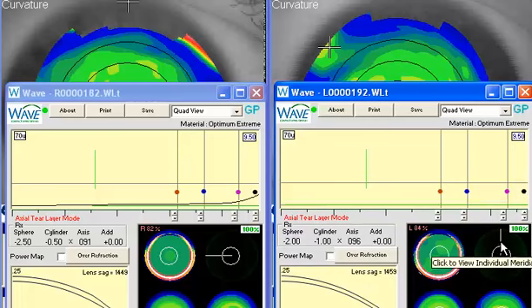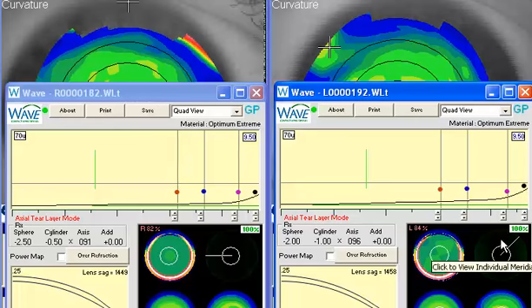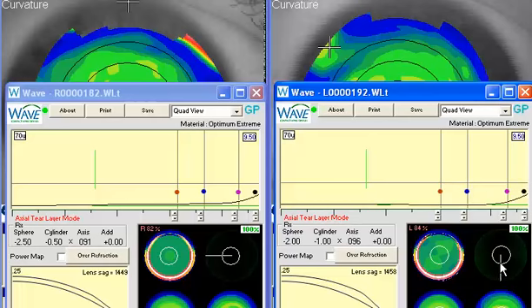I might try one more thing to see if we can get this a little bit larger. Let's bring this down here, about 6.7, oh, you're probably okay. We can bring this in here if you want, snug that up a little bit. You can bring these a little bit tighter in if you want. But this actually lends well, even though we've got a little bit of a lift here. I think you'll find that since you're under that 20 micron line, you'll still have a very nicely fitting lens. And again, that'll take out the potential for Wave to interpret the cylinder on that back surface.